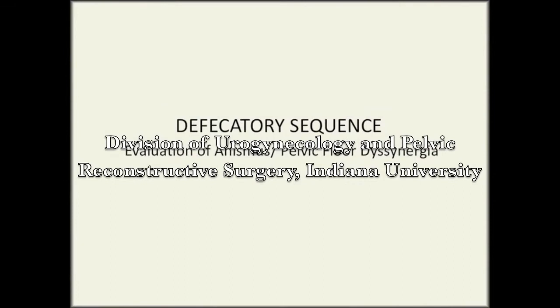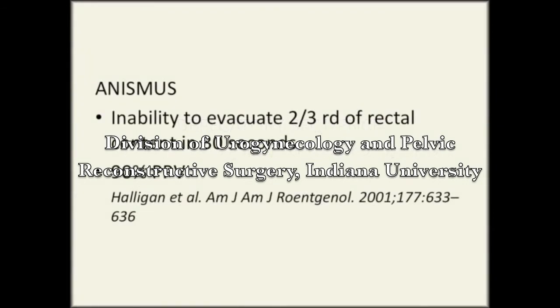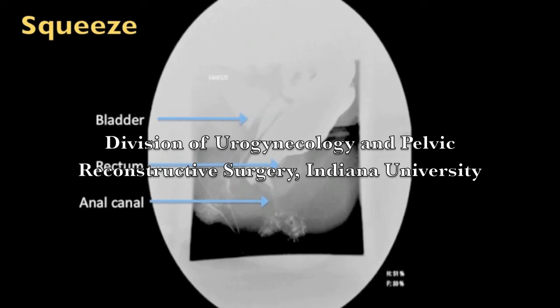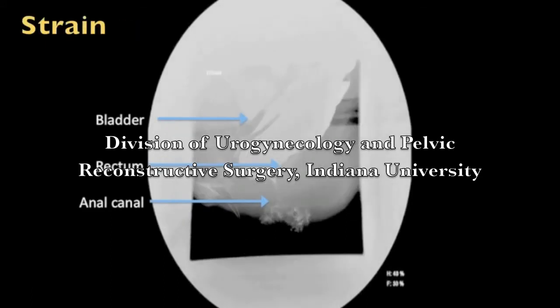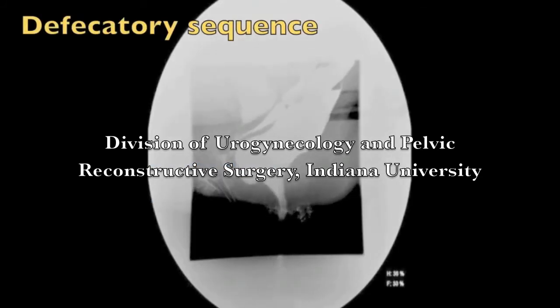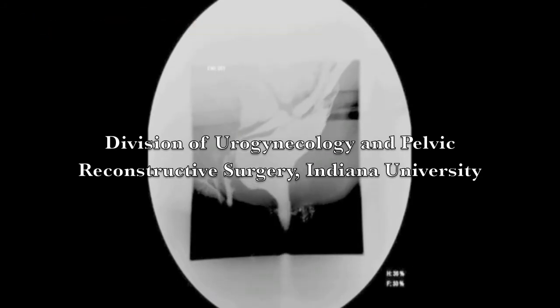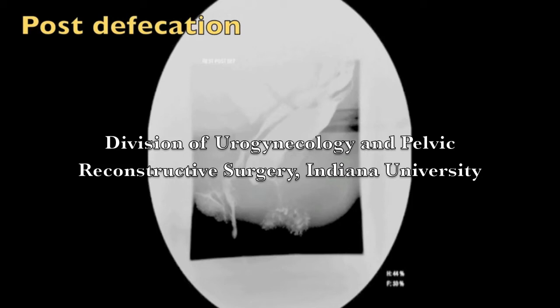Another condition that can be difficult to evaluate on physical exam is pelvic floor dyssynergia, or anismus. Radiologically, this is diagnosed by an inability to evacuate two-thirds of rectal contents in 30 seconds, a criteria with a 90% positive predictive value. This is a patient with a chronic history of constipation. A defecatory sequence is attempted and repetitive contractions of the pelvic floor muscles are seen. After 30 seconds of trying to evacuate, more than two-thirds of contents are retained in the rectum, which is suggestive of anismus.